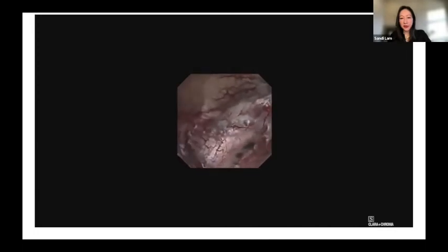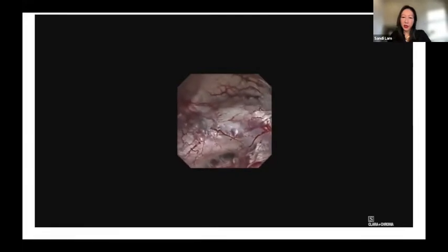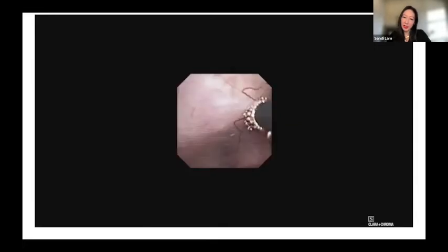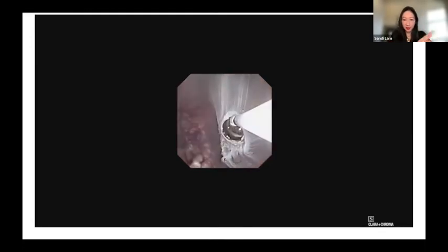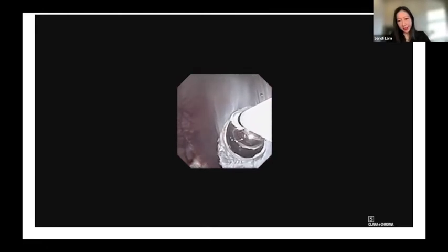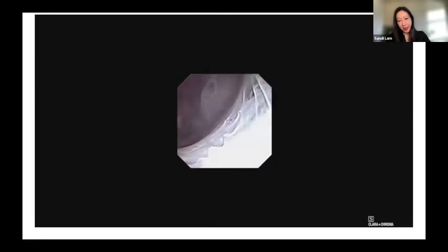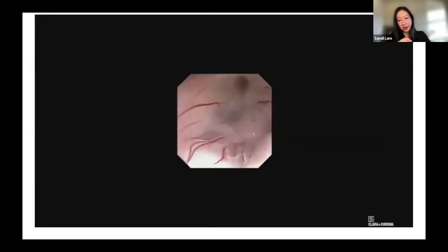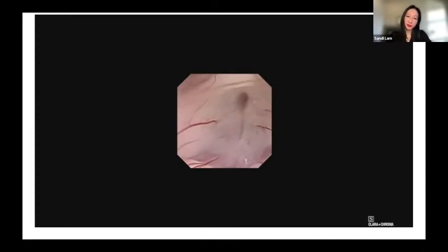Here, theoretically I've fenestrated the cyst, but really I only have one hole in it. I could probably just do an ETV. But here you can see that I connected this to power right up against the bone, and only right up against the bone, to be able to perforate that very, very floppy membrane. I had to use other tools like a Fogarty balloon because I didn't want to manipulate as I was through the aqueduct, and dilated that up. Now you can see that whole cyst has collapsed. Then I proceeded to do an endoscopic third ventriculostomy.